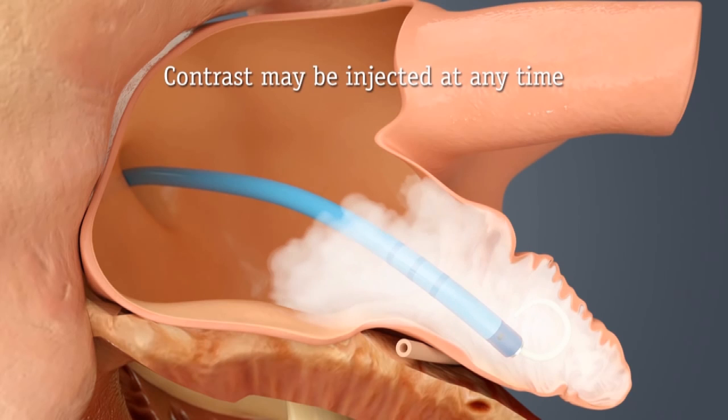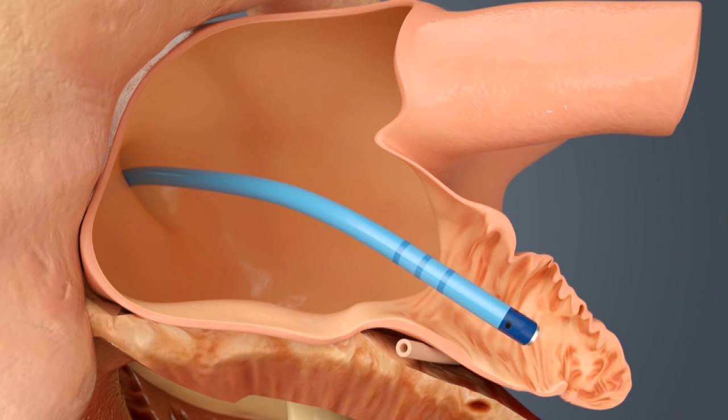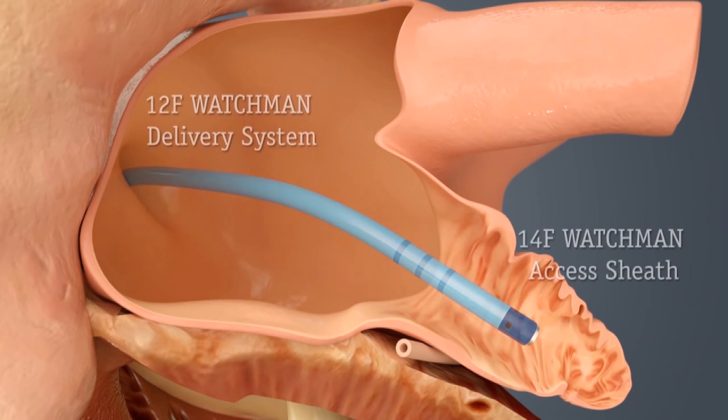The device is then loaded through the leg, through the catheter, up into the appendage. At all times, the device is tethered so that if we have any difficulty with the location, we can pull the device out. The device is then placed deep into the appendage and as it is slowly removed, it opens up.